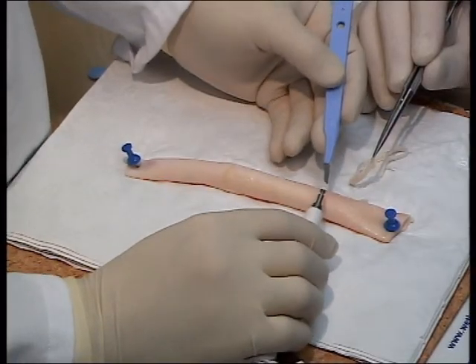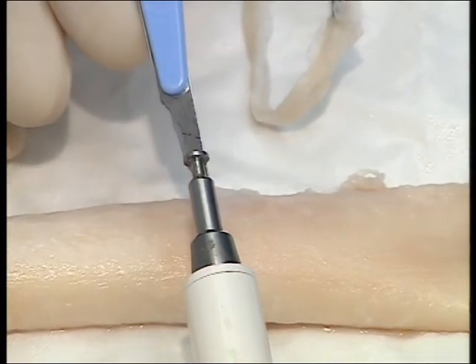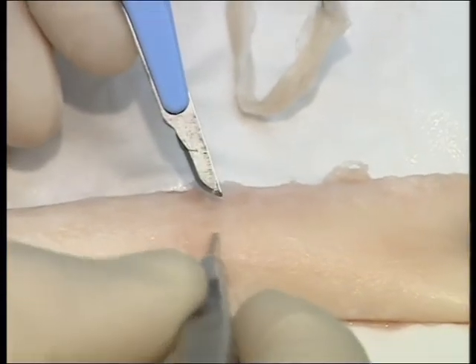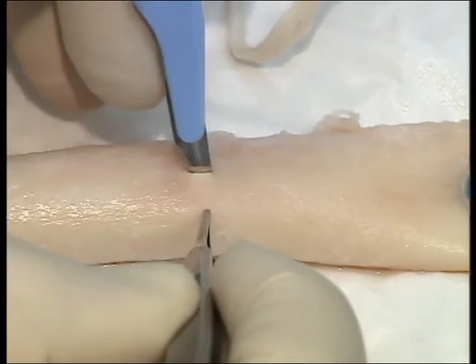To make a hole in the aorta, use a 15-bladed knife, which you will see is the same diameter as a 4mm aortic punch. Make a single stab incision in the aortic wall.